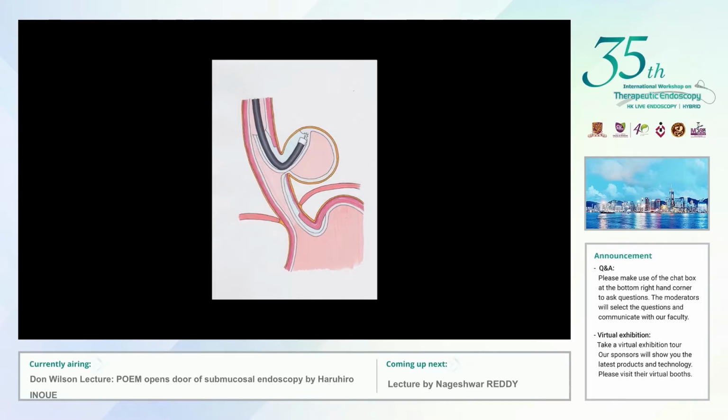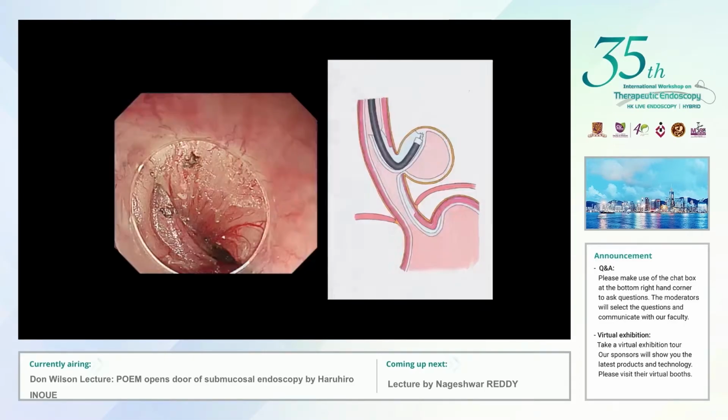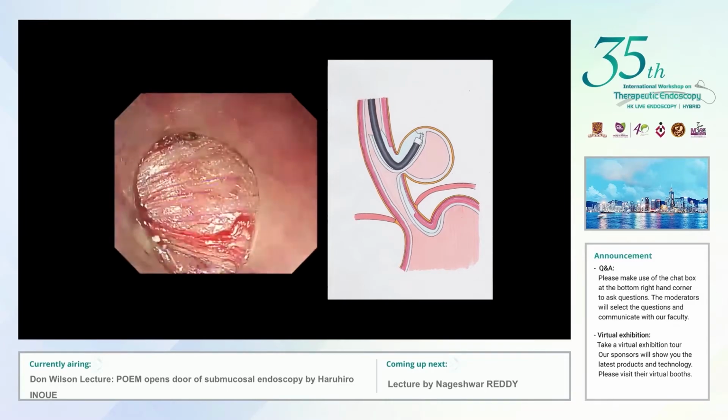diverticulum itself. This is a false diverticulum, meaning not a full layer, so just the mucosal layer we dissected. This diverticulum has no muscle layer. You can see our mucosal layer going inside the diverticulum itself.